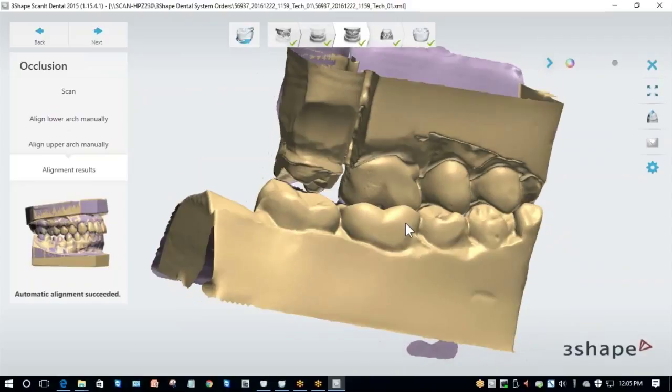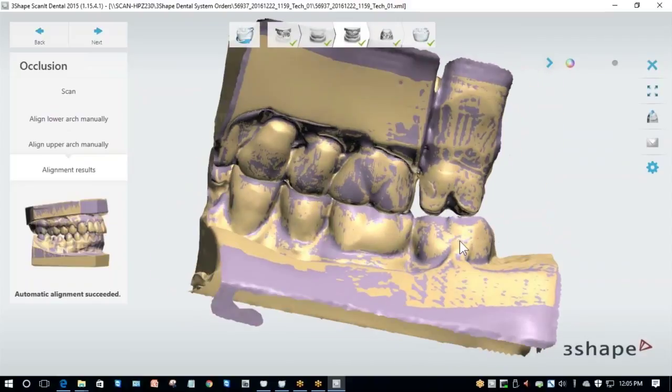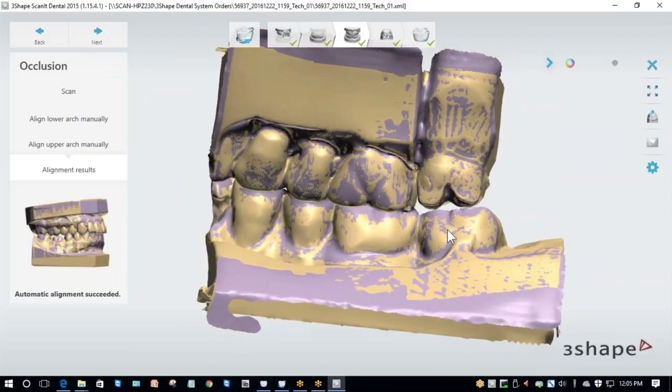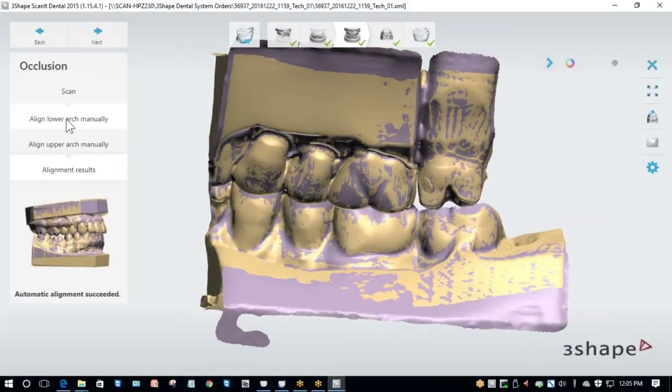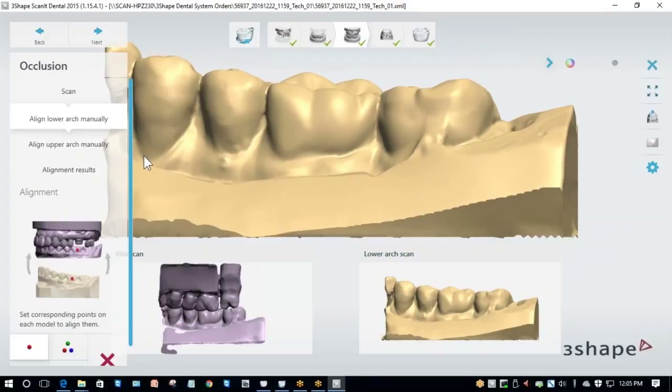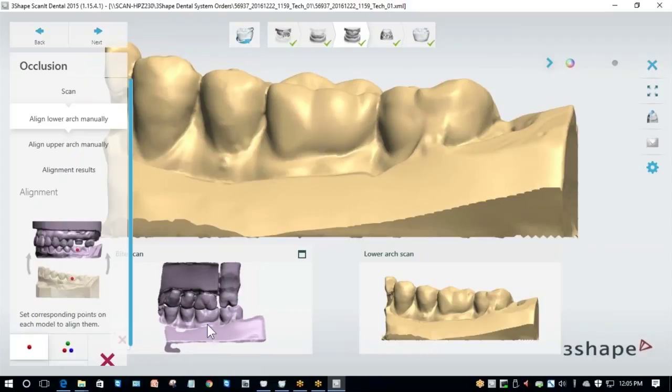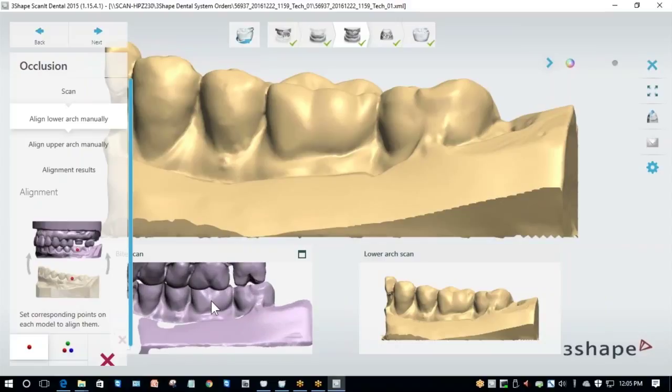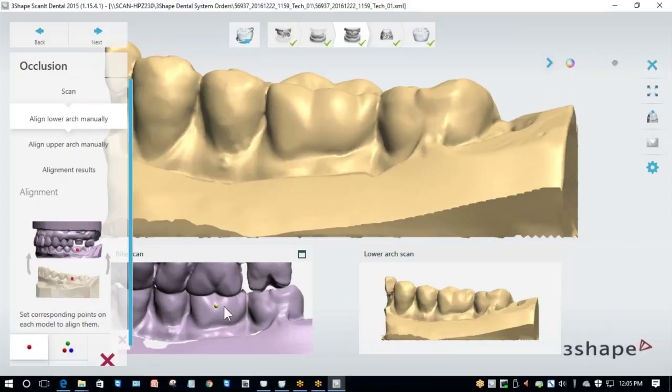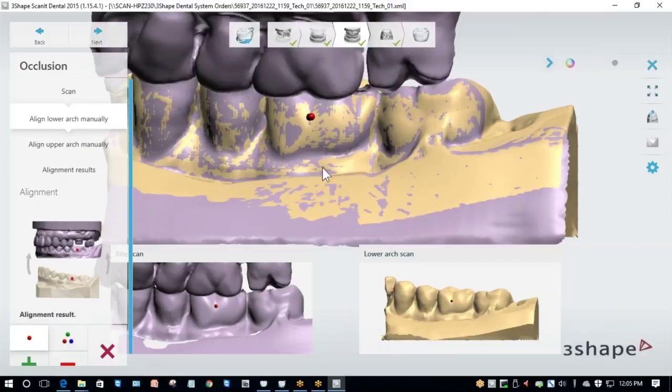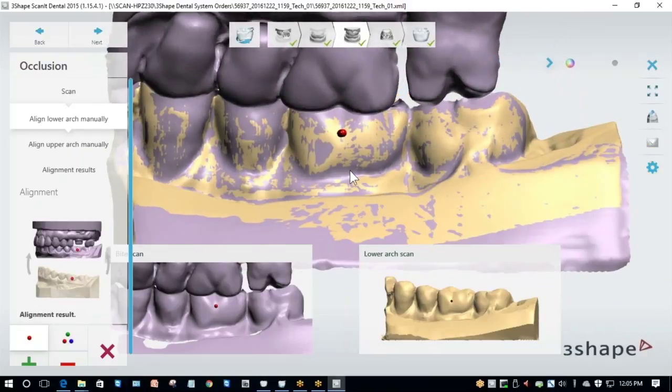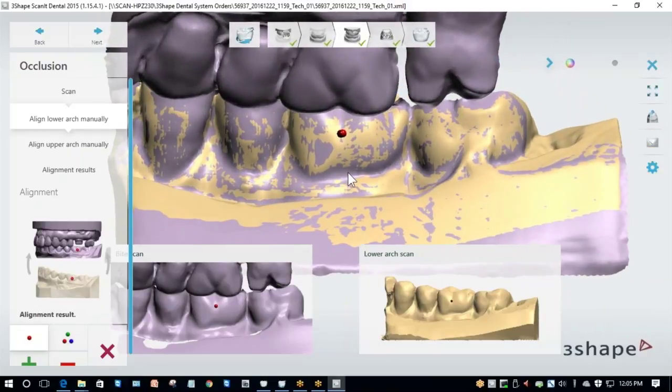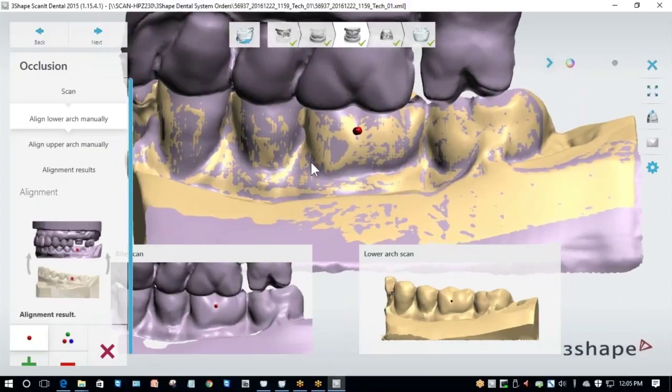Even though it properly aligned my two scans, I'm going to show you how to do the alignment manually. First, we're going to align the lower arch manually. I do this by clicking on the button right here and it takes me to the alignment screen. I have two options: one point alignment and three point alignment. You need to find similar geometry on both the purple and tan models and click a point that matches on each one. When I do that, it automatically aligns at the top and I can tell it's successful. I can tell my scans are aligned correctly because I see this camouflage pattern. As long as you see a camouflage pattern, your alignment is good.